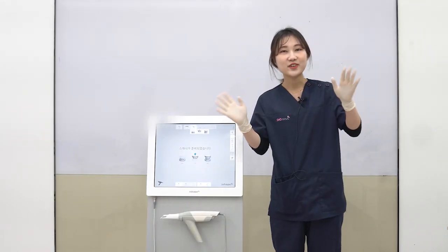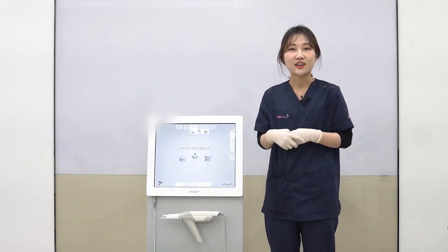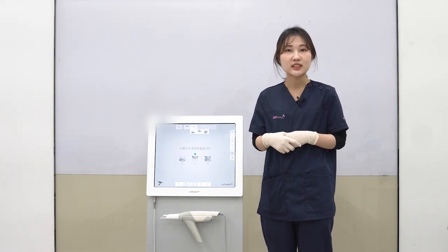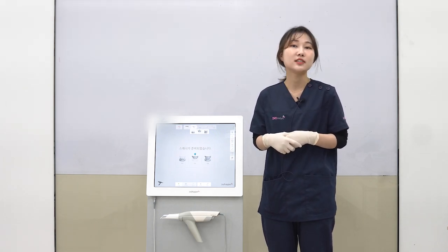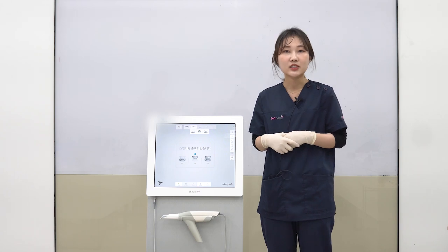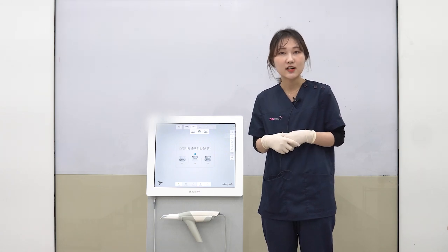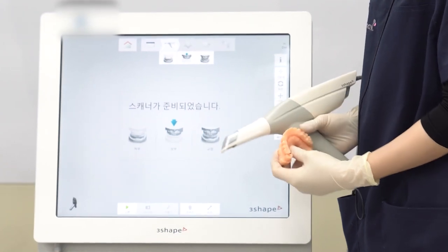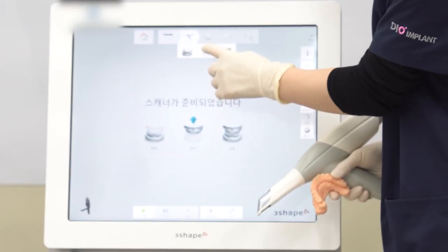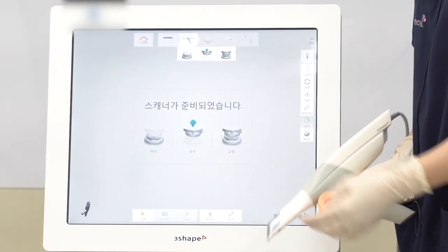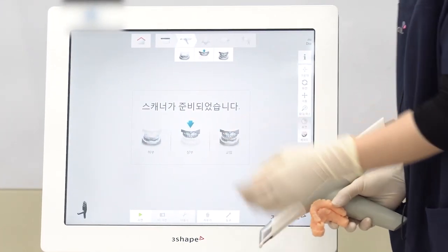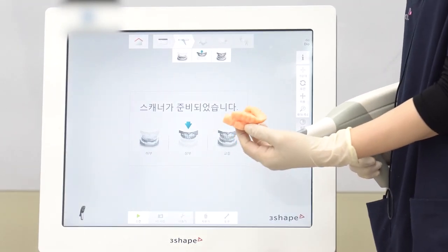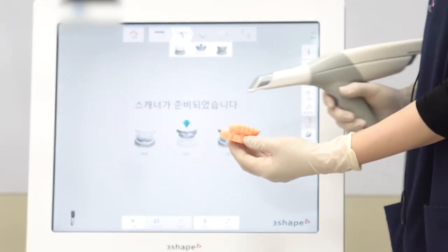Hello, today I am going to explain to you how to scan a full arch that has remaining teeth. First, we will scan the opposing teeth. Click on the maxillary and make sure the scanner is ready. Let's begin scanning. You can start scanning with the occlusal surface.